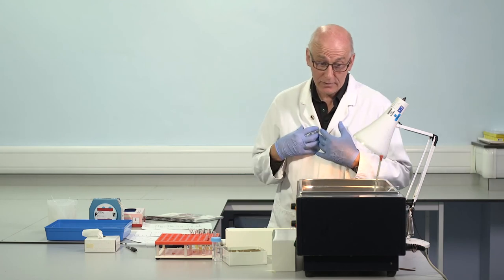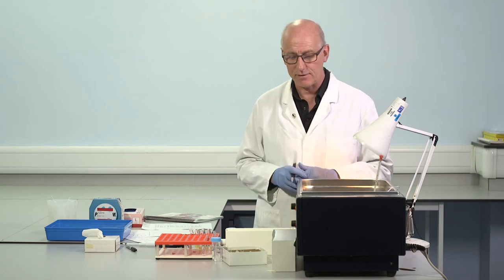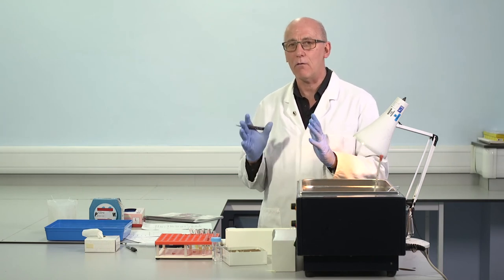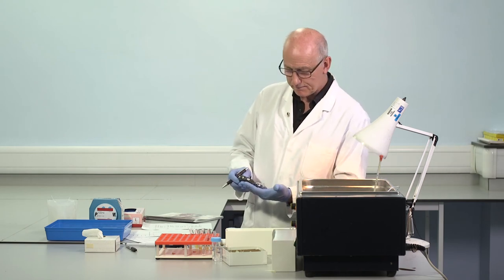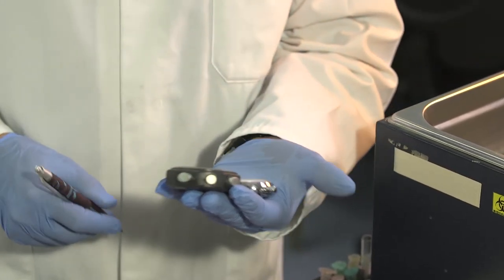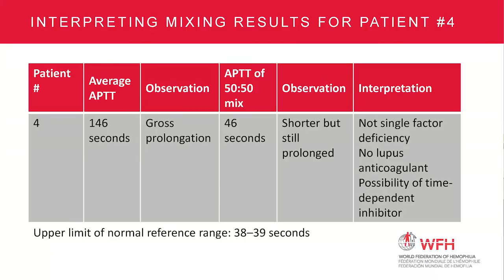So in my own centre, we use a lupus insensitive reagent as the routine APTT screening test for that reason. Again, if we're looking for lupus anticoagulant, of course we need a sensitive reagent. Patient number 4, 50-50 mix, 46 seconds. Now, if you remember patient number 4, 146 seconds APTT, grossly prolonged. The 50-50 mix is much, much shorter, 46 seconds, but it's not back into the reference range. Upper limit of reference range, 39.